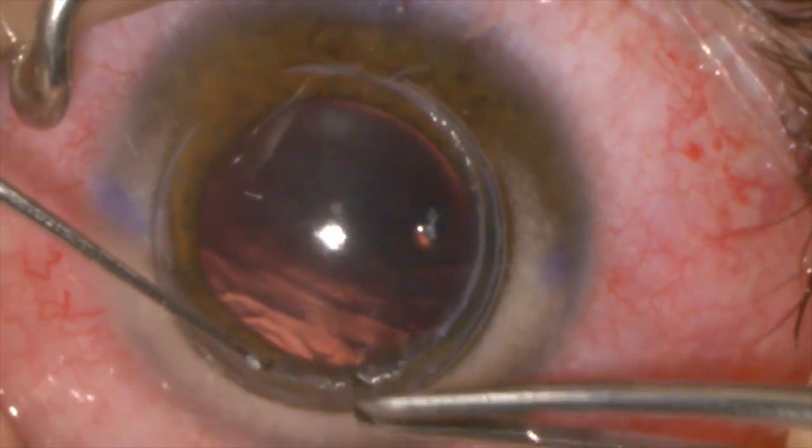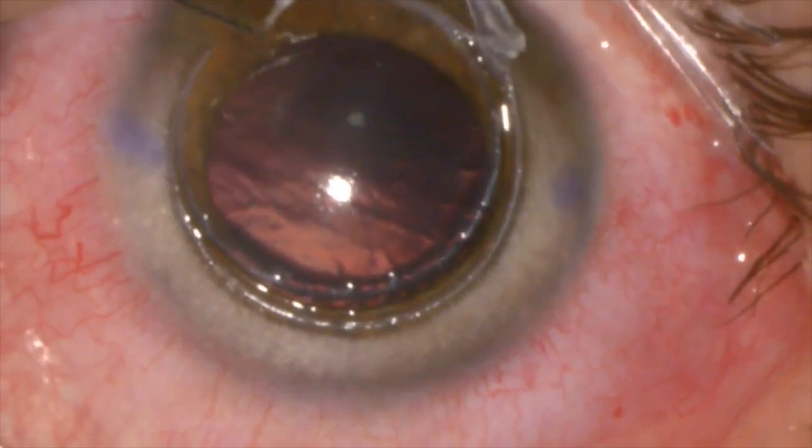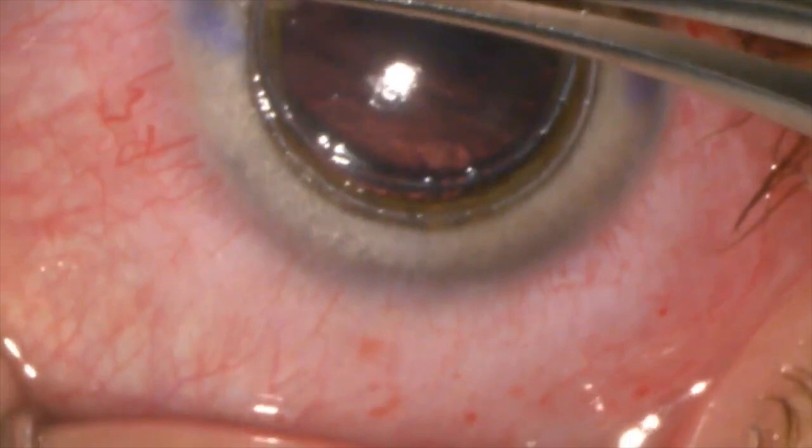Perfect. You can see here how she's removing the tissues. This is a 320 degree resection. You can see that this is different to the other, because in the other it was 270, because the other has less myopia and less astigmatism.